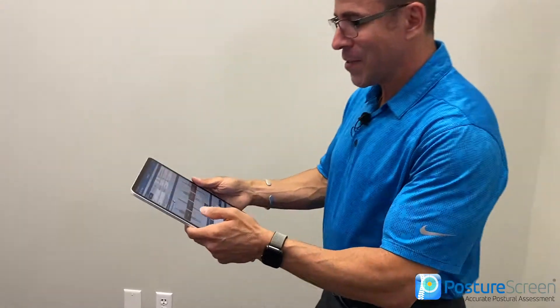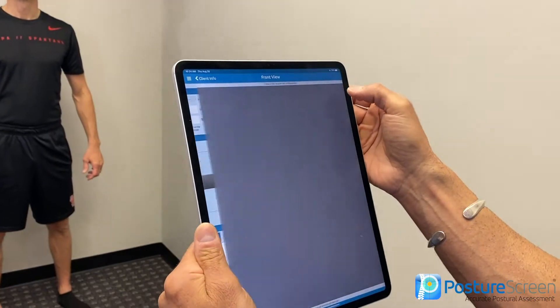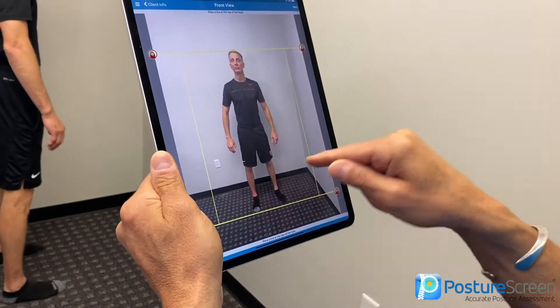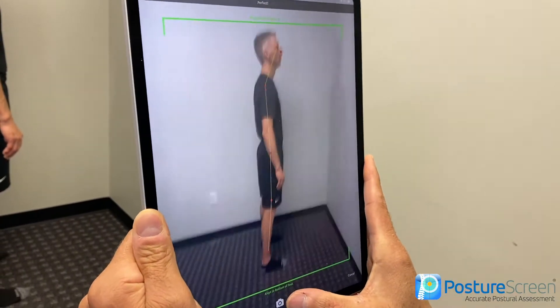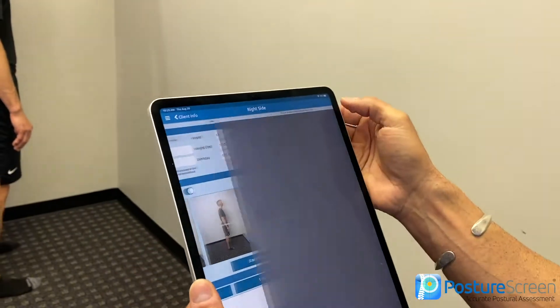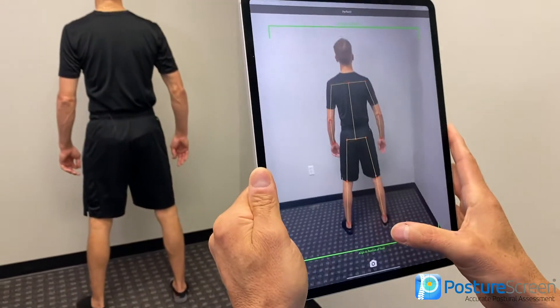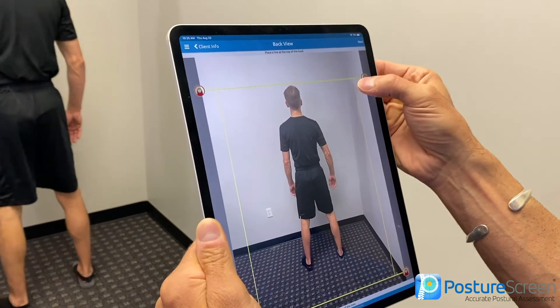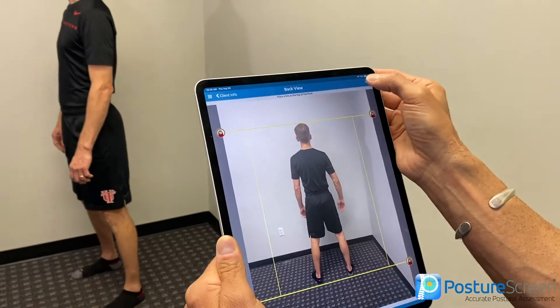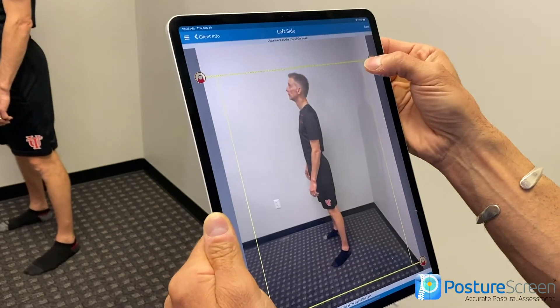Remember, his shirt is supposed to be off. So we're going to go ahead and snap the picture — we're going a little faster this time. I'm keeping an eye on the floorboard in the back to keep it as level as possible. He's going to turn towards the wall for the posterior view. He's standing nice and crooked for me — that's good. Always make sure it's green.